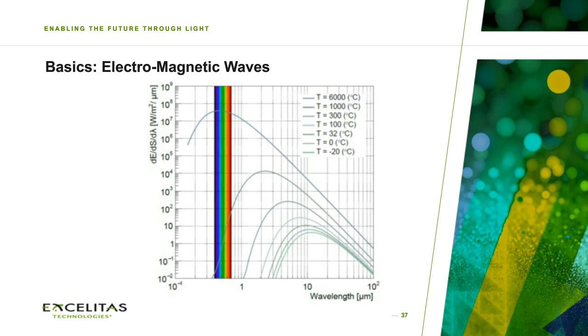And you can see it's a logarithmic scale, so there is 1 micrometer, 1, 2, 3, 4, 5, up to 10 micrometers, and then it goes to 100 micrometers. Below 1 micrometer, you can see that there is some rainbow-like structure. This structure is the visible spectrum. Each electromagnetic wave with this wavelength is visible to the naked eye of a person. Everything to the right is infrared, so not visible to the eye, as well as when you go to the left, to the ultraviolet, and then to X-ray radiation. This is also not visible to the eye.